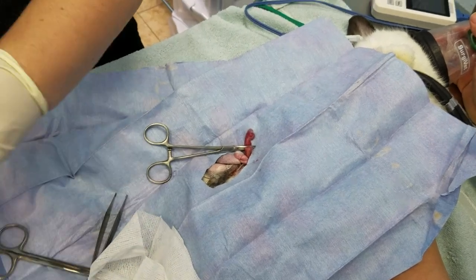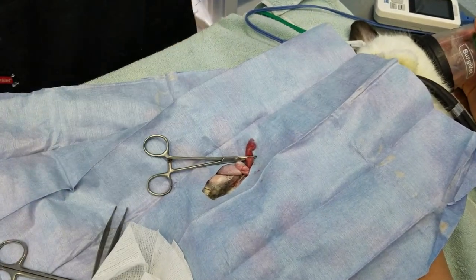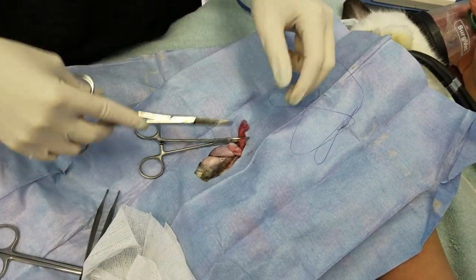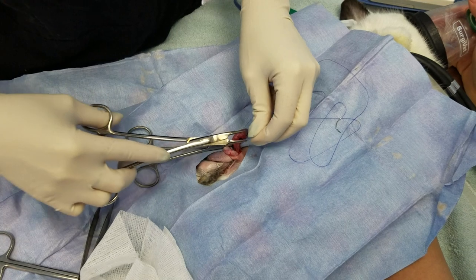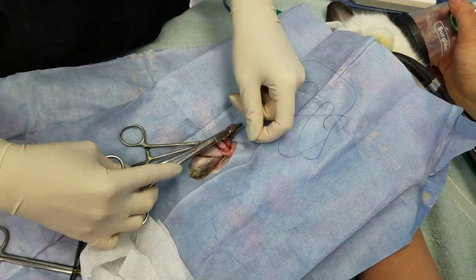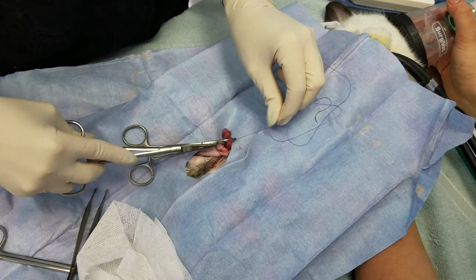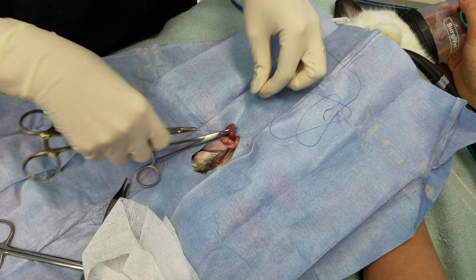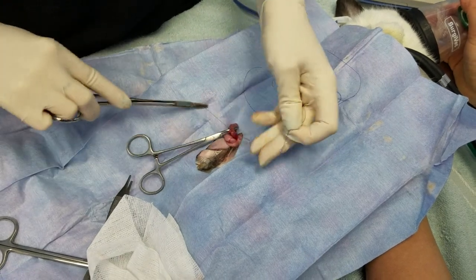Right. And I'm going to use a modified Miller's on the pedicle. I'm using 4-0. We're circling around twice. Hemostats through the loop and pull. Cinch that down nice and tight.